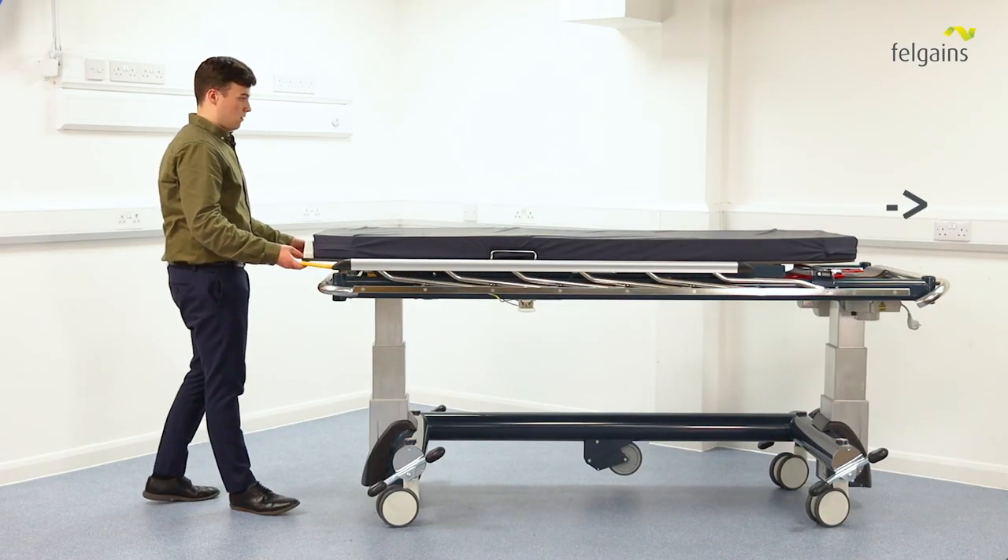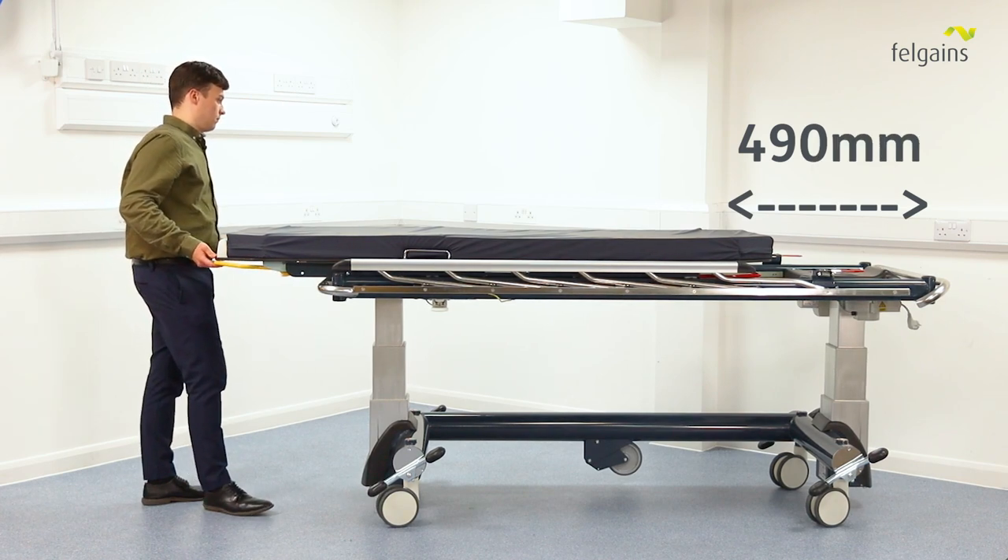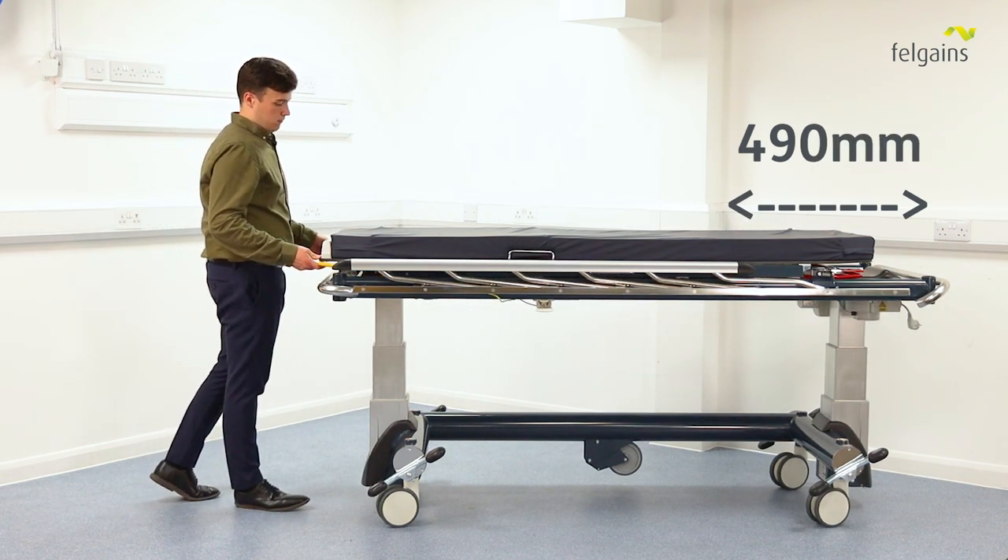This can make getting a correct and accurate image difficult if you have to keep moving the C-Arm. The ImageFlow stretcher slides 490 mm longitudinally, allowing you to move the mattress platform to get the correct image instead of the C-Arm camera. This can improve speed and efficiency in your imaging.